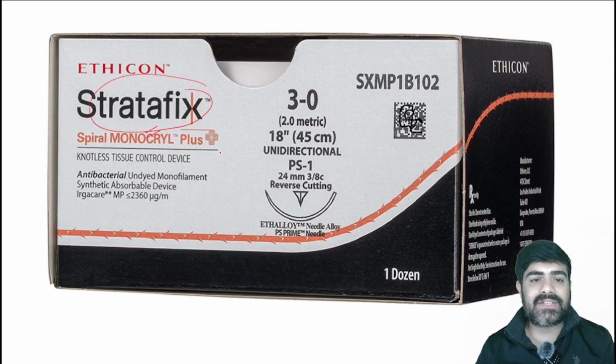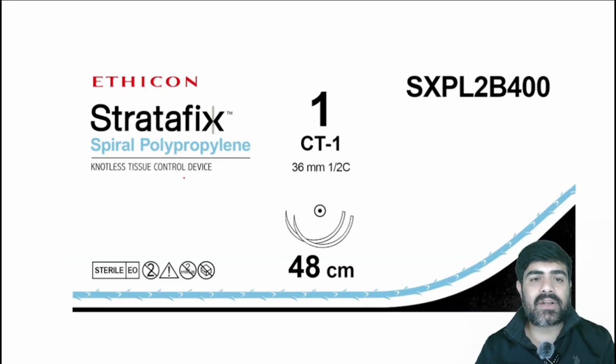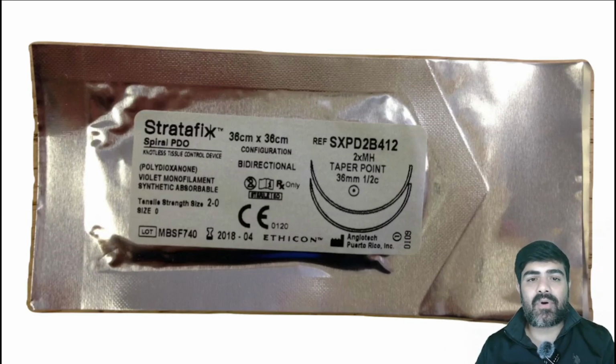So here Monocryl is used, so this is an absorbable suture. This is Stratafix symmetric PDS. Again, an absorbable suture is used here, PDS. Then Stratafix spiral Prolene, so here the non-absorbable suture is used. So again, it can be absorbable or non-absorbable. See, this is Stratafix synthetic absorbable, which is bidirectional.